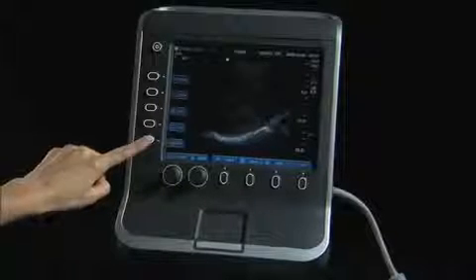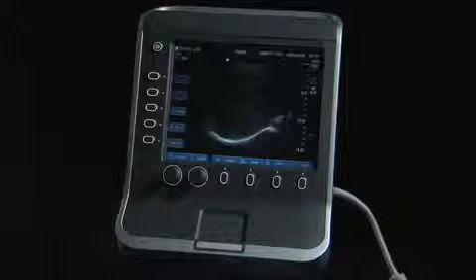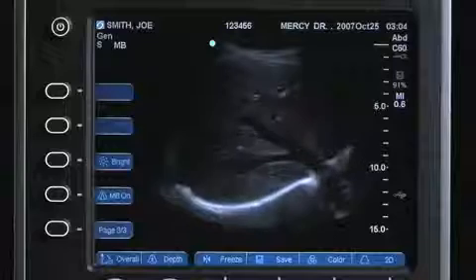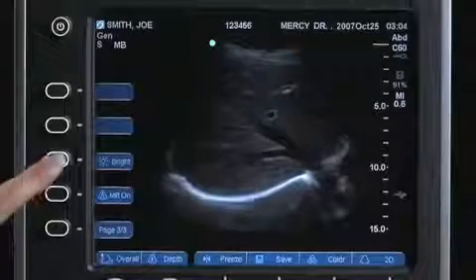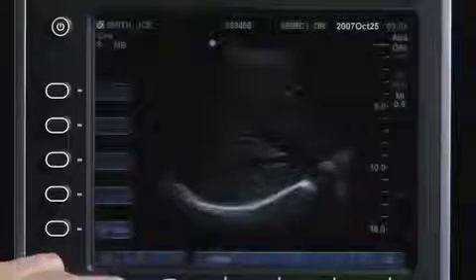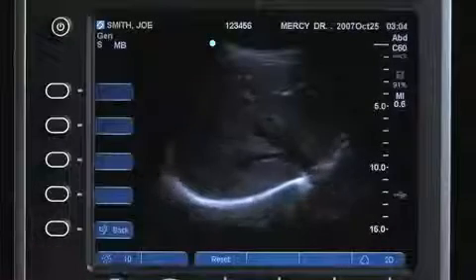Page 3 of the secondary controls contains controls for image display brightness and SonoMB. To change the system screen brightness, select a setting from 1 to 10. Reset will change the setting to the system default level.